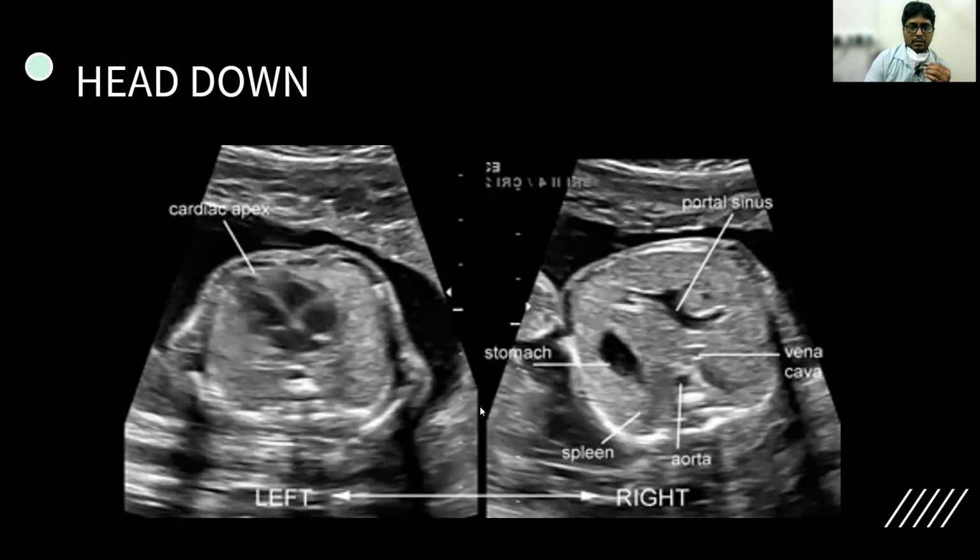In terms of a cephalic presentation, as you can see in this case, the vertebra is at the same level, but the stomach is at 1 o'clock position in relationship to the vertebra. 1 o'clock, 3 o'clock, or on that side of the clock. Now, this is very important to determine the situs.